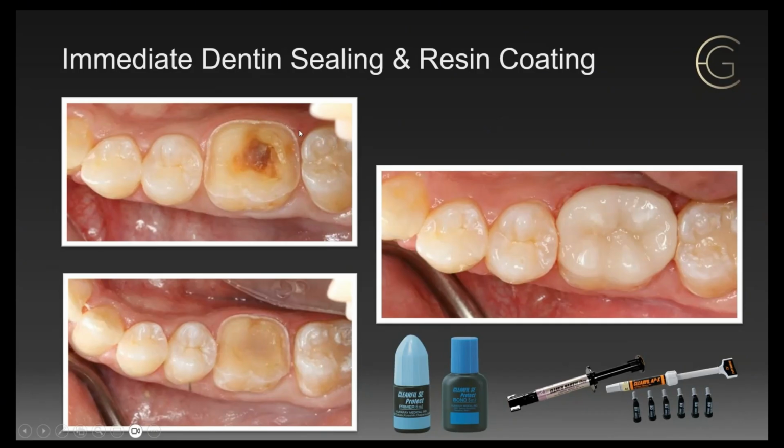So when we go back to this preparation, I was told countless times you cannot bond a zirconia, and you certainly can't do it as a partial coverage. Well, in this case, I picked a lady who was so nice to let me do this. We actually published this case. I ended up removing this decay as well. We had to drop a little bit on the lingual, but the buccal was high and dry. There's no retentive grooves. And so we did the IDS and resin coating.